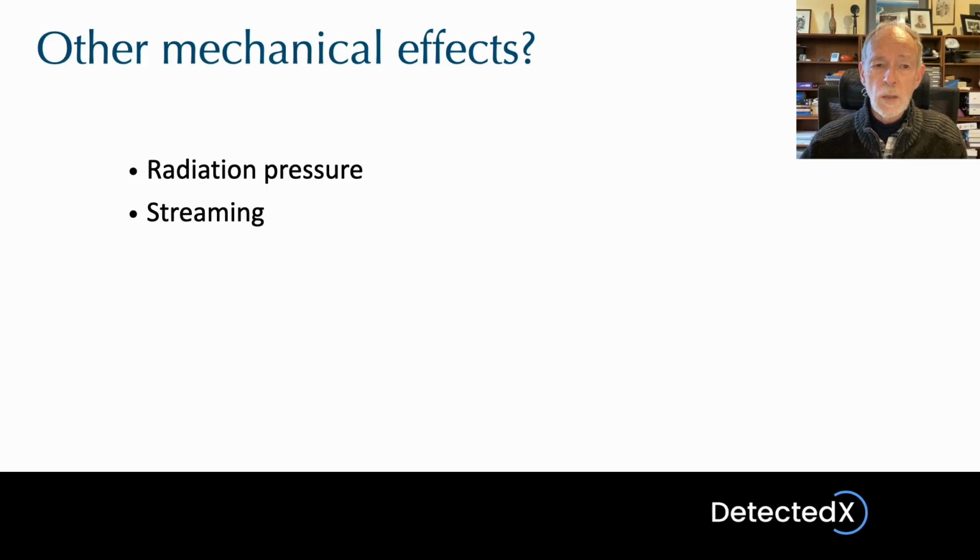There is one way in which it actually is visible or can be seen, and that's the phenomenon known as streaming. If you have a liquid with particles in it and you expose it to ultrasound, the radiation pressure on the particles within that liquid can cause them to flow away from the transducer.